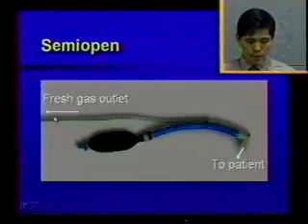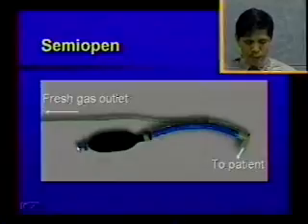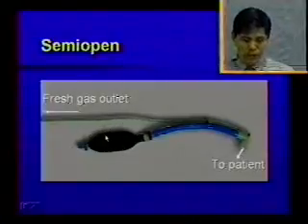And this is where the oxygen and the inhalant anesthetic will pass then into the animal. This portion here is the part that is attached to the scavenging system. And as you could see, there is a reservoir bag, and there are no valves in this system.